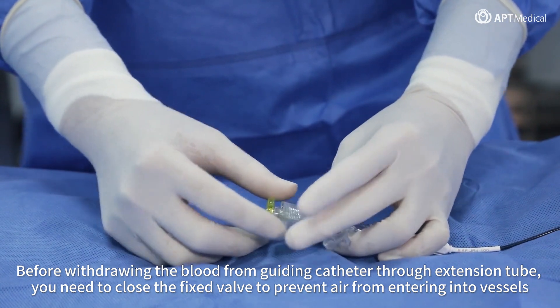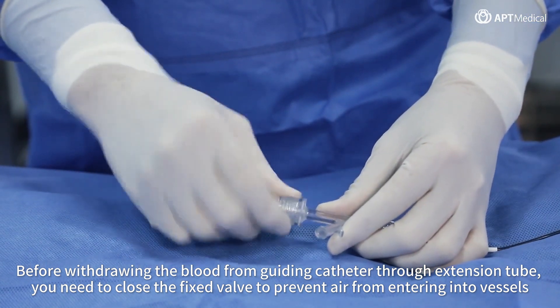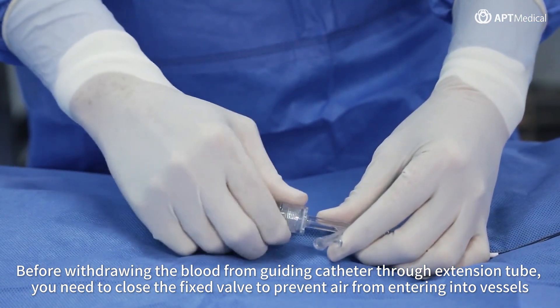Before withdrawing blood from the guiding catheter through the extension tube, you need to close the fixed valve to prevent air from entering into vessels.